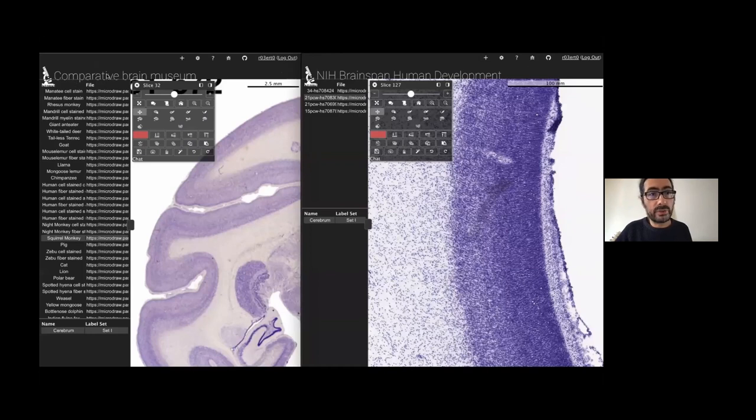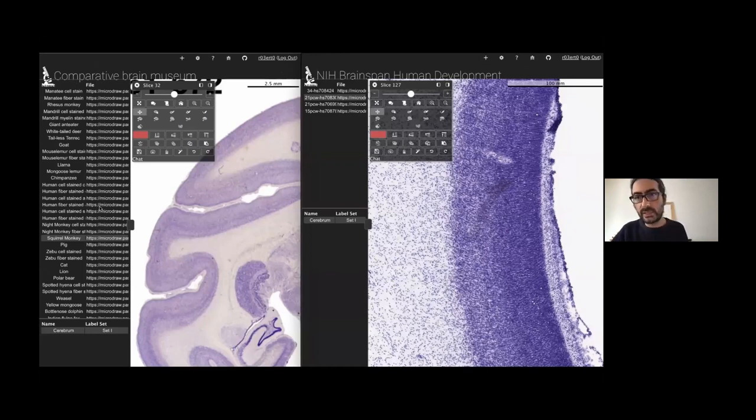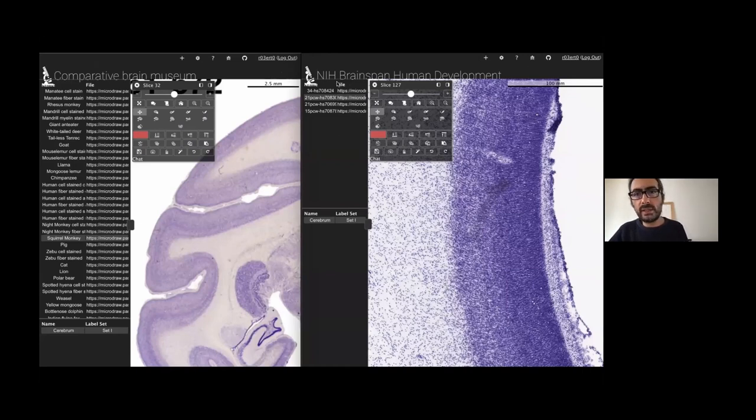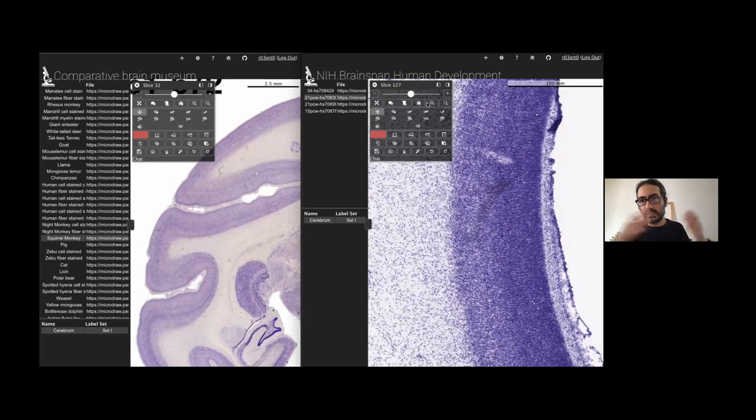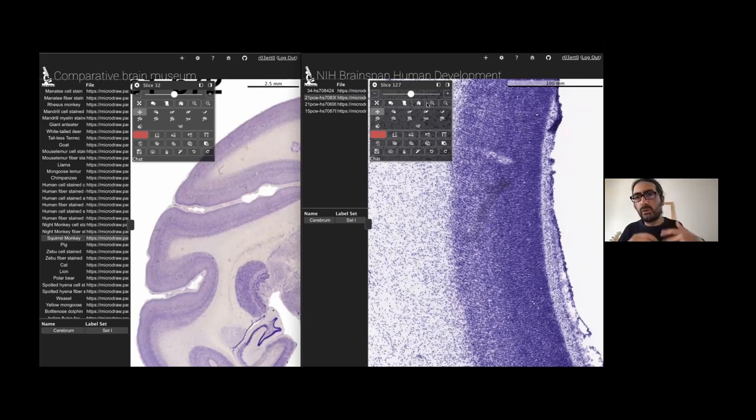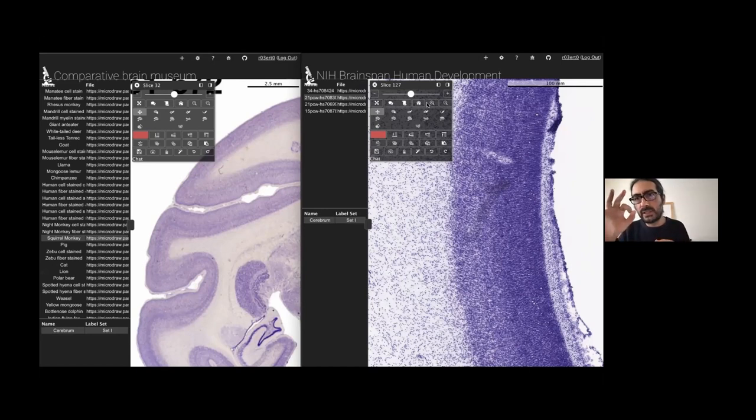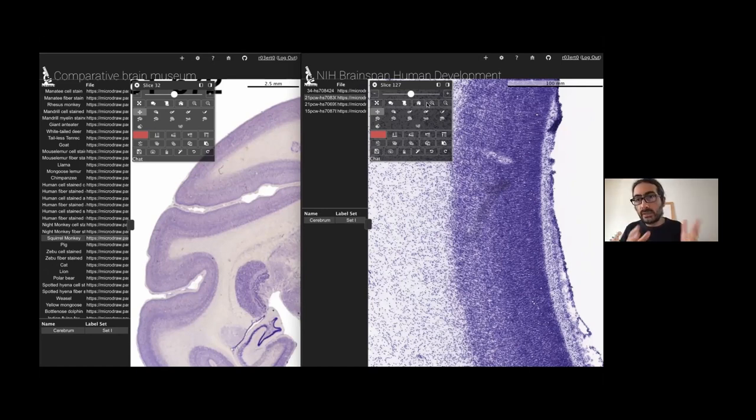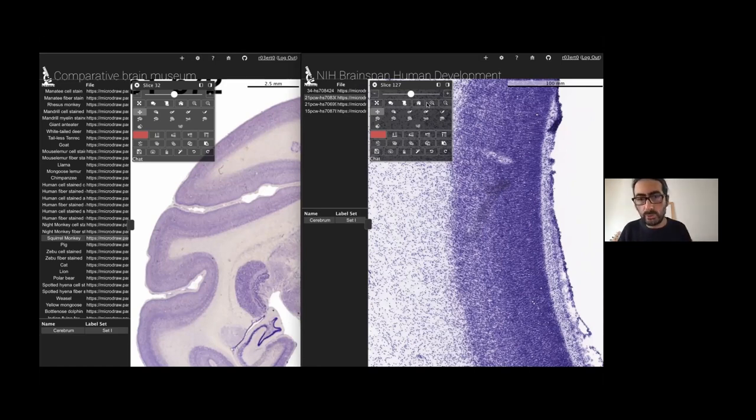And also, for example, data from the Comparative Brain Museum, which is a beautiful data set where Katia has already shown you a bit how to work with that. And NIH BrainSpan human development. There's a lot of data sets that you can only view on the web, or even sometimes just have a tiny thumbnail. Here, you can work collaboratively on that data and start using it for your own analysis.